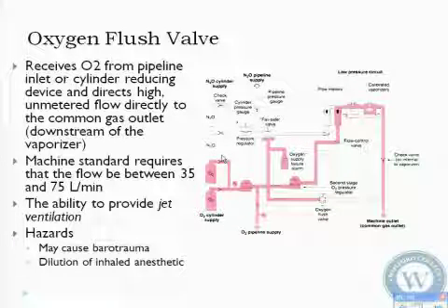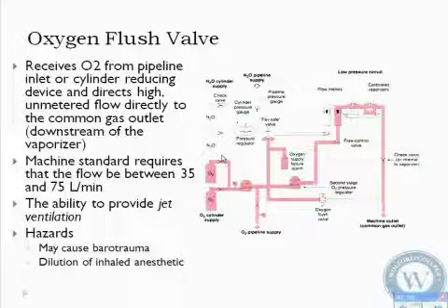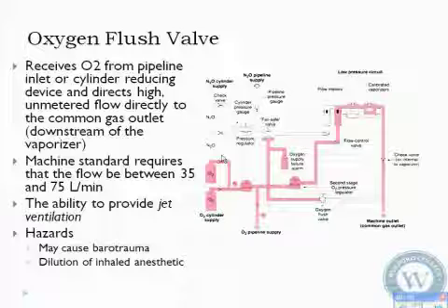The only time that you would is if you had to do transtracheal jet ventilation. Other than that, we use it simply to fill our bag up. When we're beginning spontaneous breathing, like when we squeeze a bag, if our APL valve was all the way open, it's going to squeeze it all out to the expiratory side. Our bag compresses, and then we have to flush it to expand our bag again. All right, so it's just so we can rapidly fill it up.